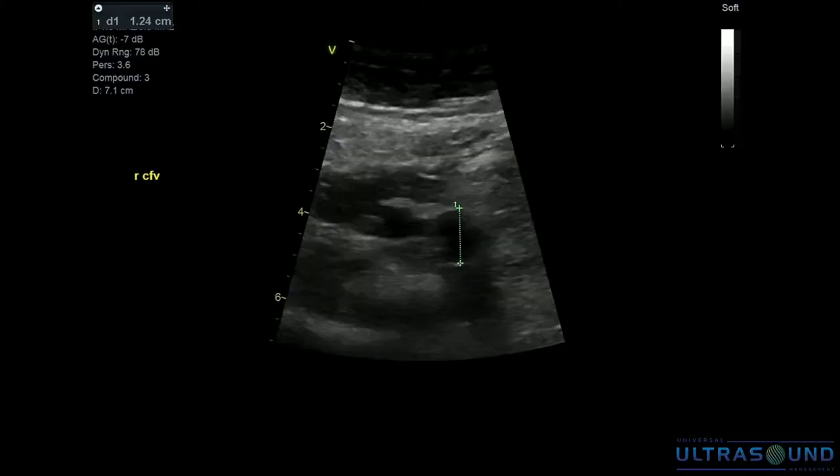So again, when Barbara came into this lab at this time, she was positive for a deep vein thrombosis in her bilateral lower extremity veins. When that happens, we changed an algorithm in our facility that if we see thrombus at the common femoral vein level or bilaterally, we insonate the outflow veins, in addition to other factors which we can summarize at the end of this broadcast.